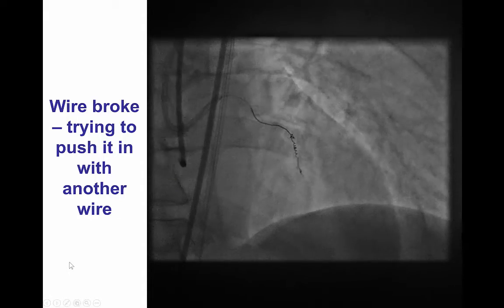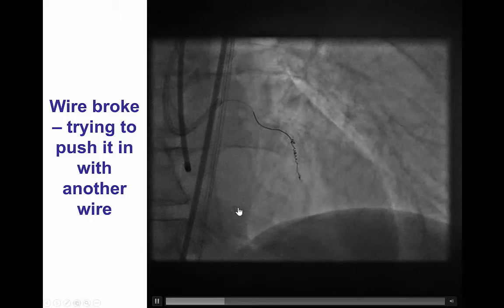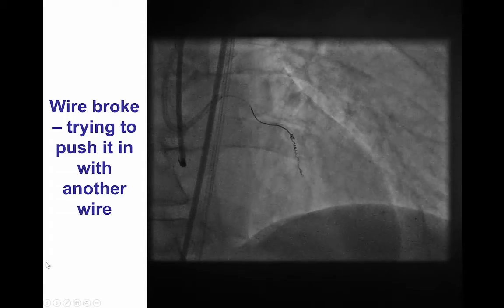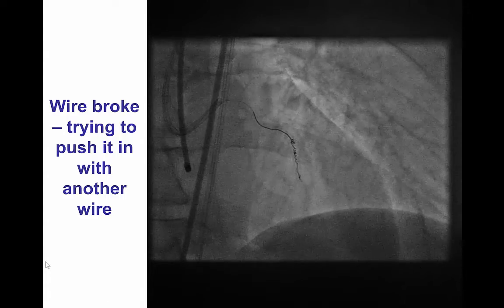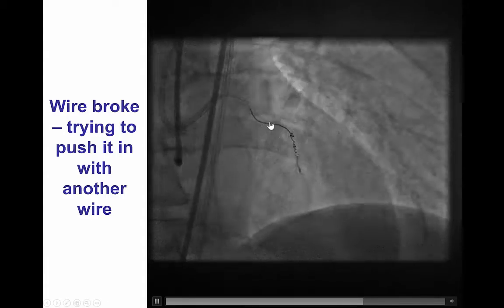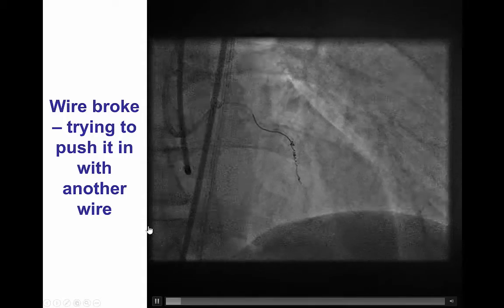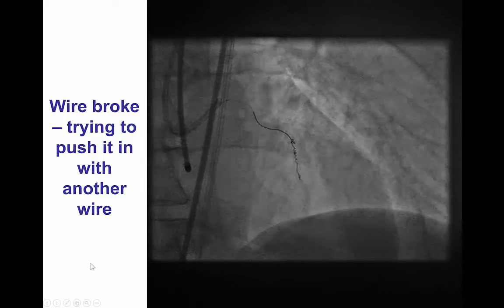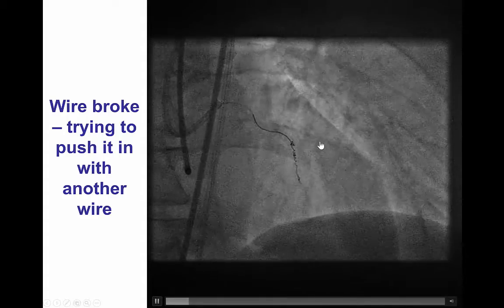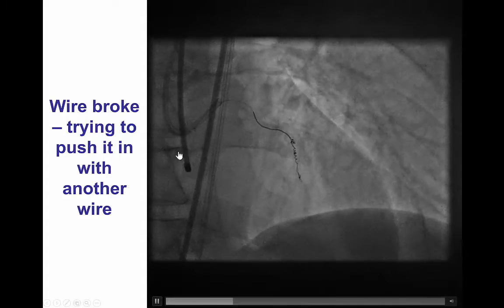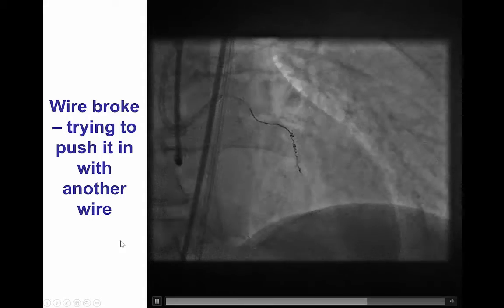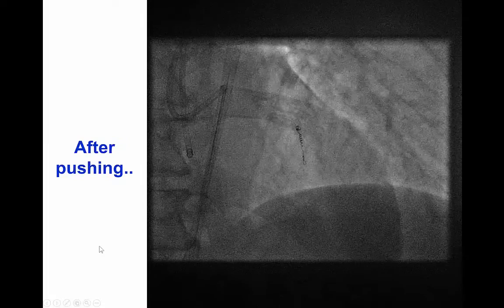In cases like this, it may be very hard to actually retrieve the wire, although of course that's the most desired outcome. However, in many cases, if there is not much wire going back, putting a stent around this wire and essentially trapping it against the vessel wall might be a good option. So that's what we'll try to do in this case — push through the Finecross with another guidewire to push out the wire and potentially cross and crush with another stent.